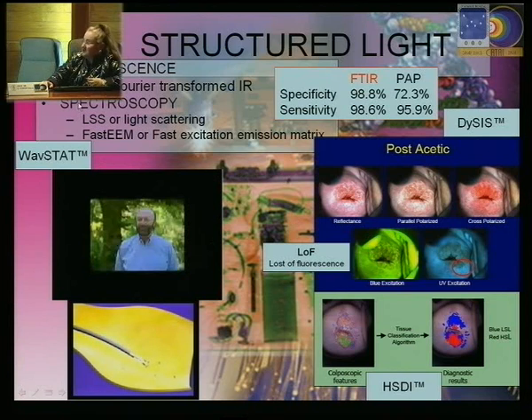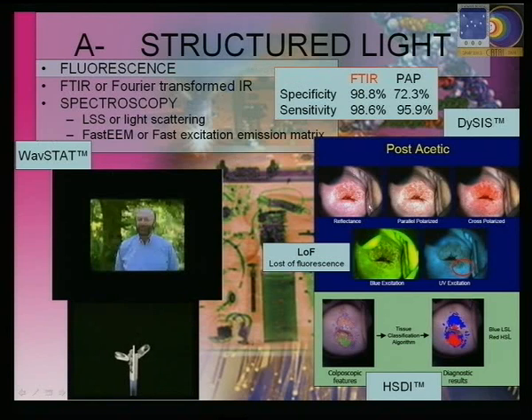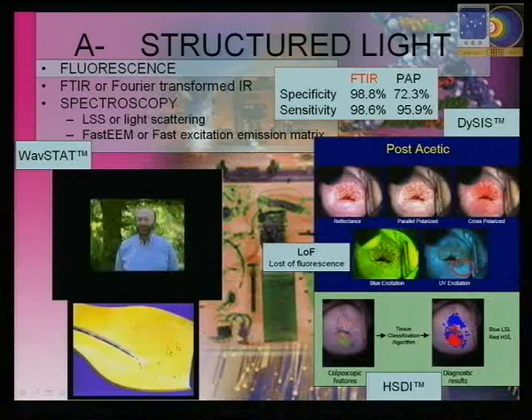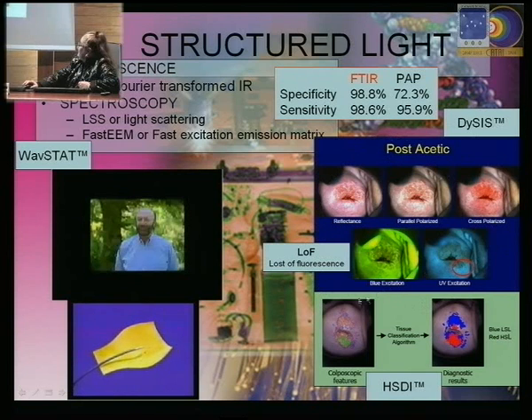Plus this, which is non-image data, it is also called spectroscopy when you use different colors, so that means different light spectrums or different image responses from the tissue. They also call it spectroscopy, although no, it's not the classical spectroscopy, it's another type of spectroscopy, which also includes the images. The classical one are these ones.